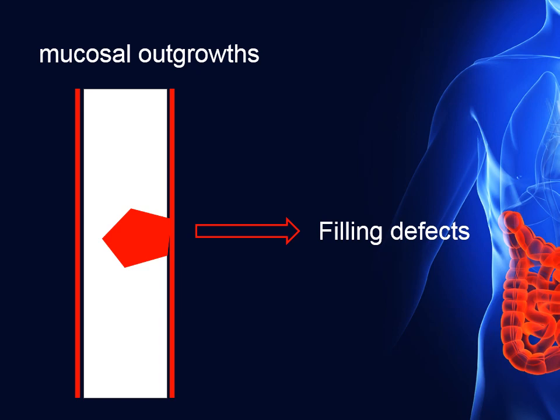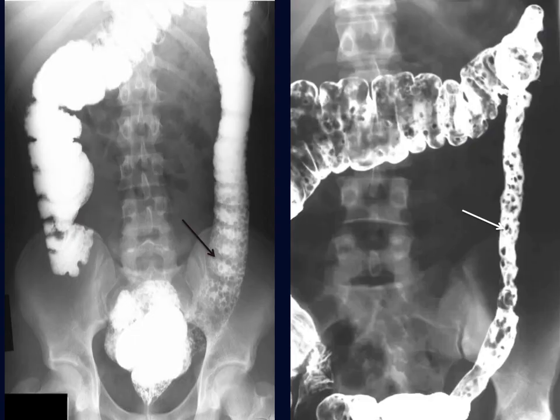The third pathology is polyposis. Polyposis is a mucosal outgrowth that prevents the contrast from totally opacifying the lumen, leaving a part not opacified by the contrast — a filling defect. This is a picture of polyposis showing total opacification of the lumen by the contrast apart from multiple small filling defects, shown as single contrast and double contrast.